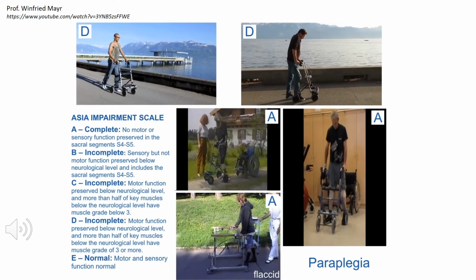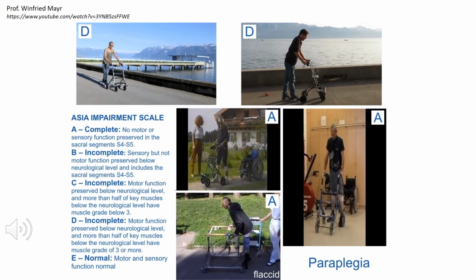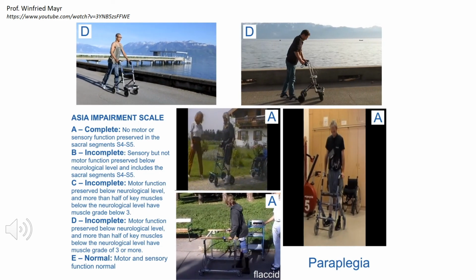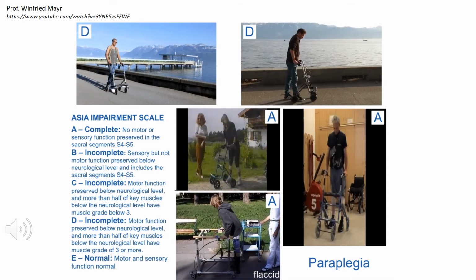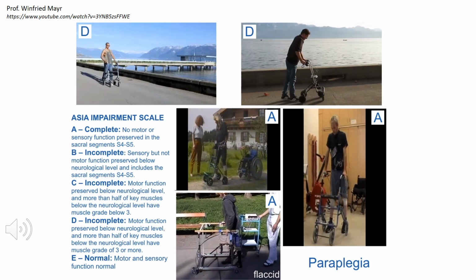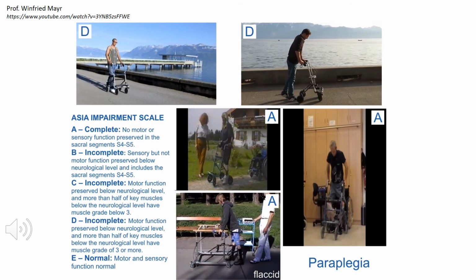In the upper scale we have an implant for epidural stimulation, and the most special patient is in the middle at the bottom. This lady has denervated lower extremities, so she doesn't use neuromuscular stimulation, but she has muscular stimulation because the nerves have disappeared.